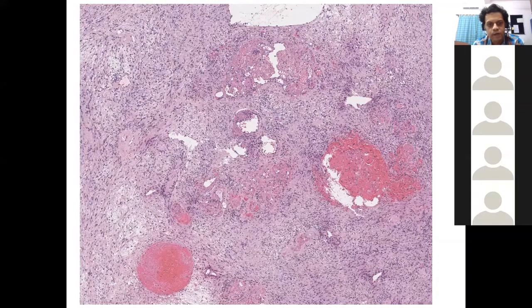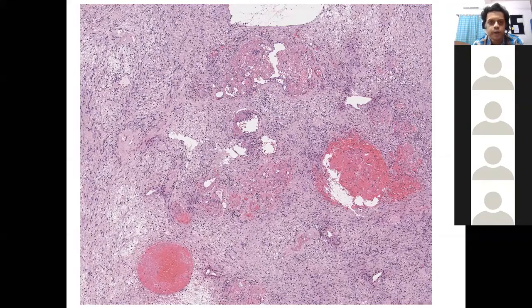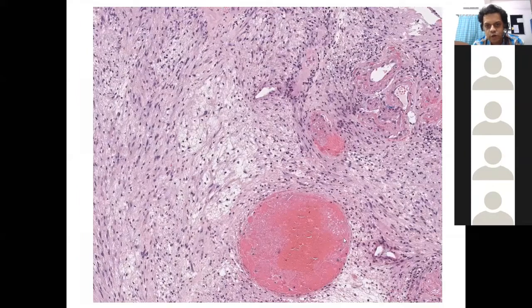Okay. And there's a lot of microcystic change, meaning this edematous, slightly vague cystic appearance in the background. A lot of these congested large vessels, which you'll get to see. And this particular thing, I will show it in subsequent slides for the sake of the juniors, because this is one important feature which we'll sometimes get to see in angiomatous lesions. And in that case, you need to identify that particular thing. Okay, so that's all we are seeing over here. This is the Antoni B region. So you have this congested large vessel with thick-walled smaller vessels as well, and a slightly microcystic edematous appearance.